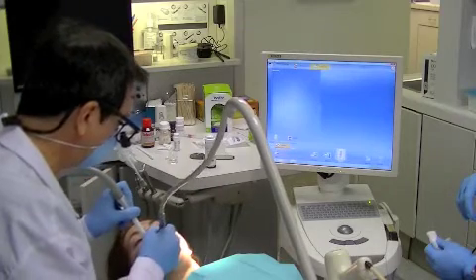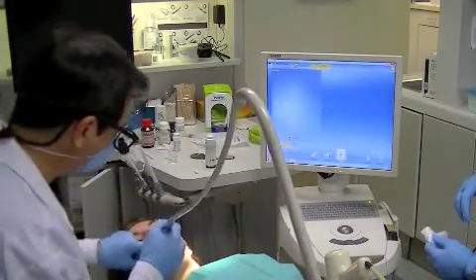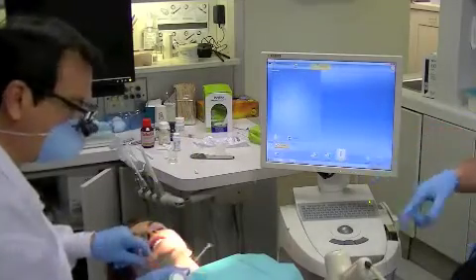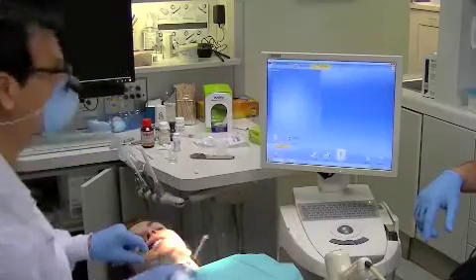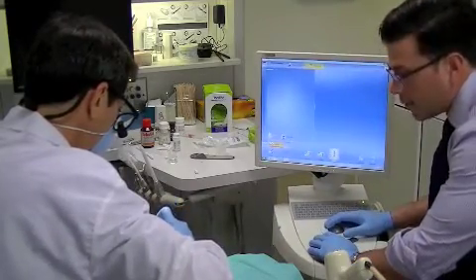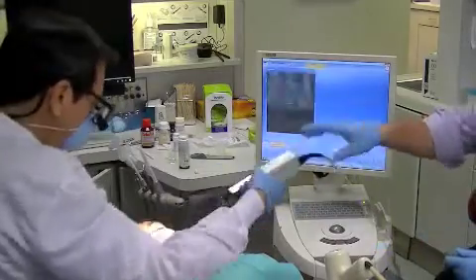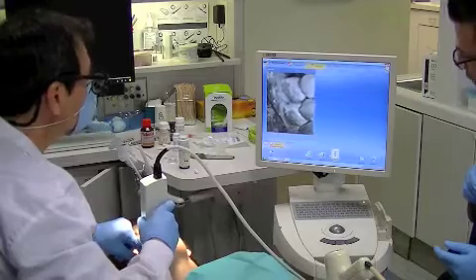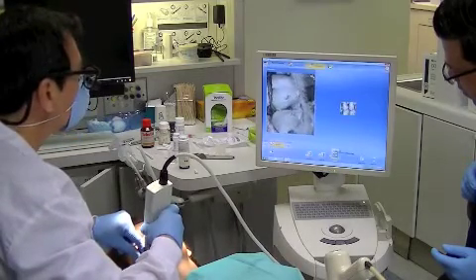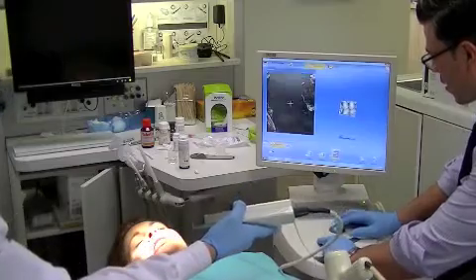It's usually better to leave the powder on. When doing the buccal bite at this point, you want to leave some of the powder there so you don't have to put that much. If you want to just try to do it clean, that's fine — I can spray a little bit on, I just want to make sure it's dry. Try to get it as flat as possible. That's enough, and that's the full digital process.